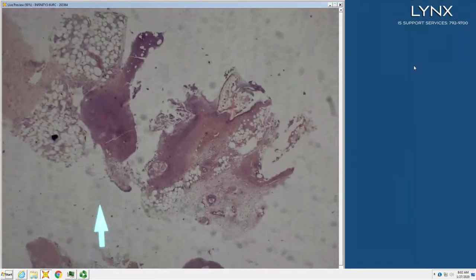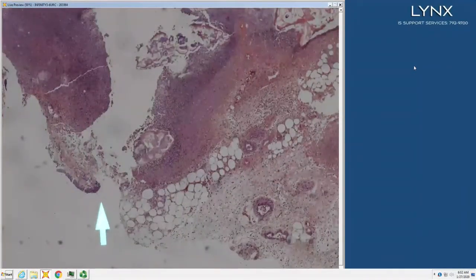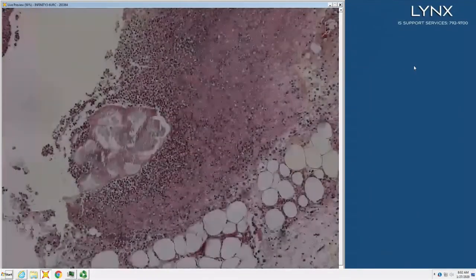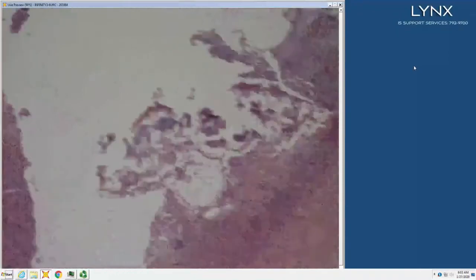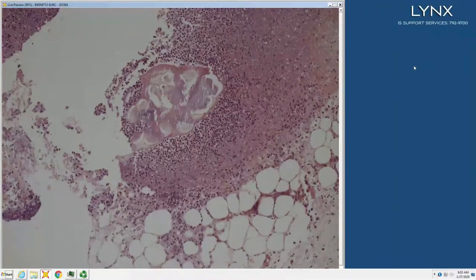So there's a deeper infiltrate. I'm going to tell what type of cells those are. So there's some neutrophils here, but what's going on there? Deposit of something. That used to be fat. Okay. So is it like a panniculitis, like pancreatic? Like pancreatic panniculitis. And so you hope your patient has gallstones, right? Yes. Because if they don't have gallstones, what do they probably have? The tumor in the pancreas. Pancreatic cancer.